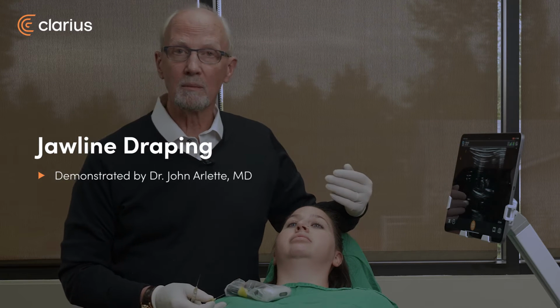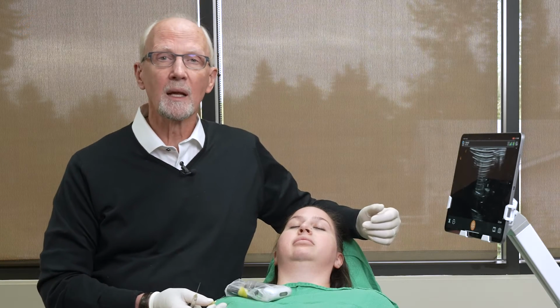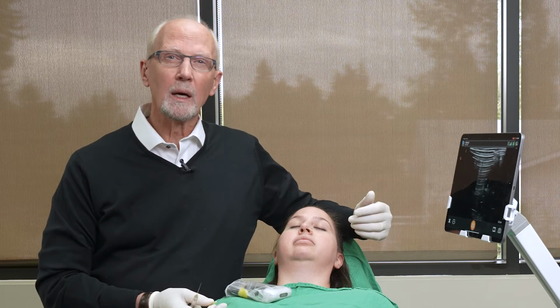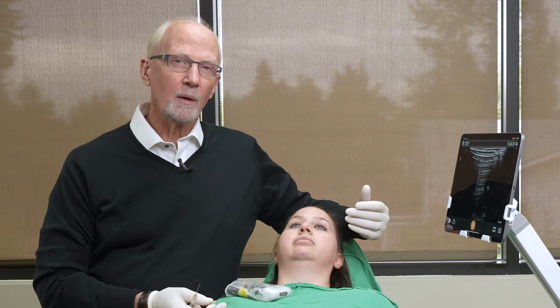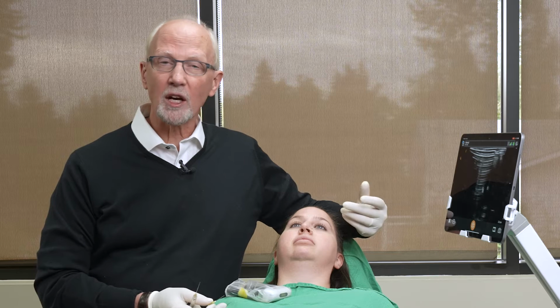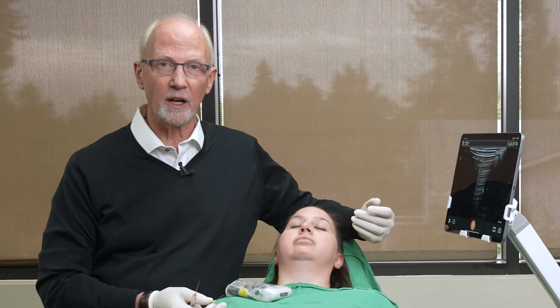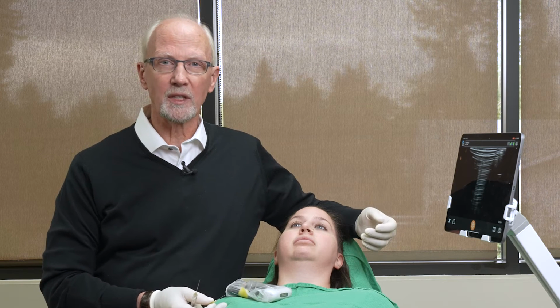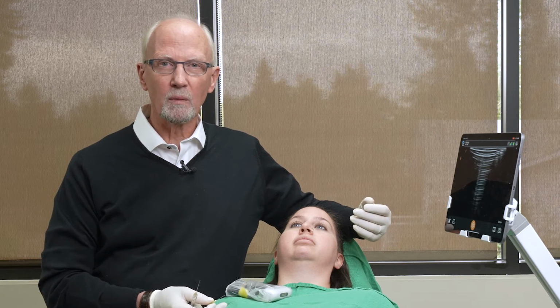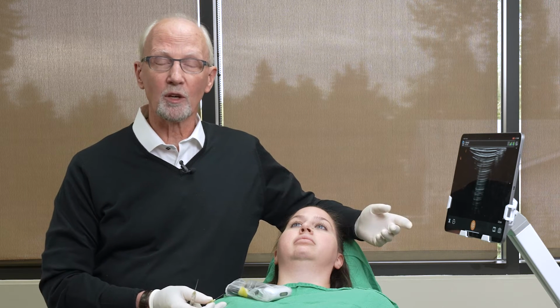We're going to do some ultrasound work while we're doing some filler treatments. Part of it we're going to show ultrasound guided injection. We're going to look at when the product is exiting out of the cannula to give us an idea of where it is, and for you to see what it looks like when it's happening underneath the skin. We'll do it with the color mode on, and we'll do it with the color mode off.